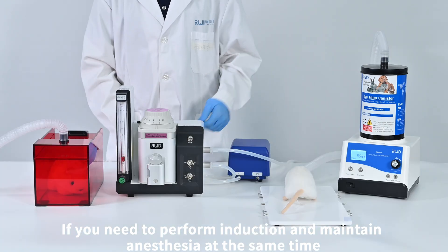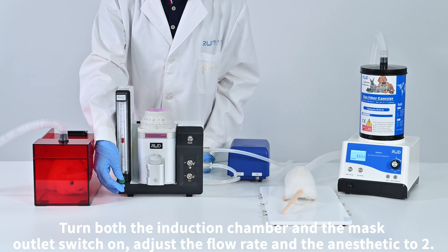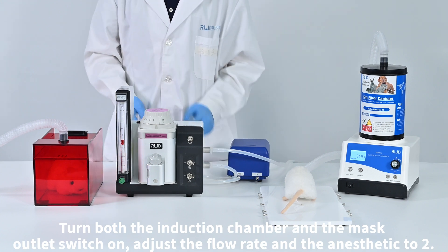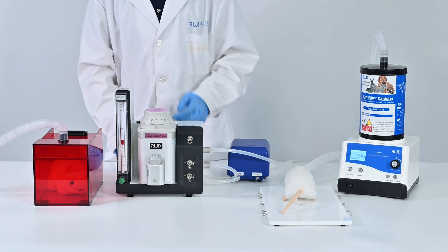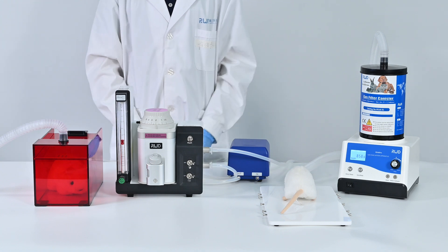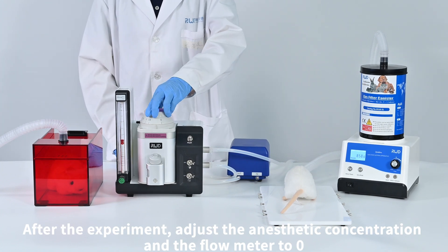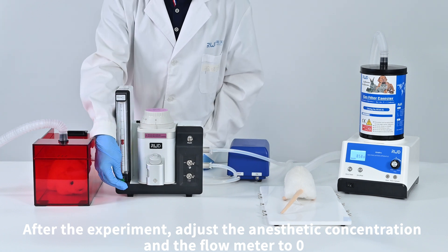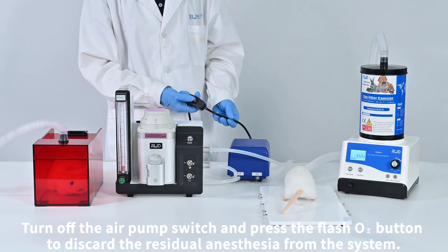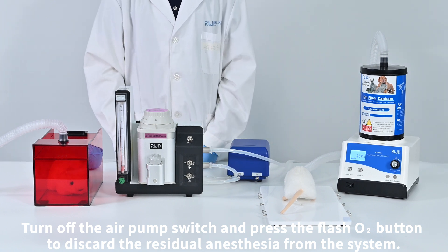If you need to perform induction and maintain anesthesia at the same time, turn both the induction chamber and the mask outlet switches on and adjust the flow rate and anesthetic to 2. After the experiment, adjust the anesthetic concentration and the flow meter to 0, turn off the air pump switch, and press the flush oxygen button to discard the residual anesthesia from the system.